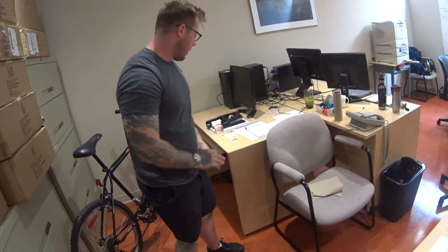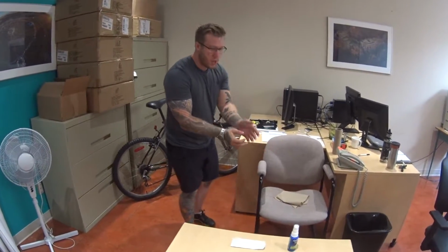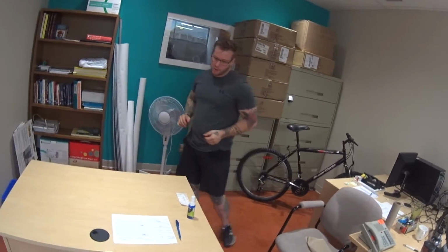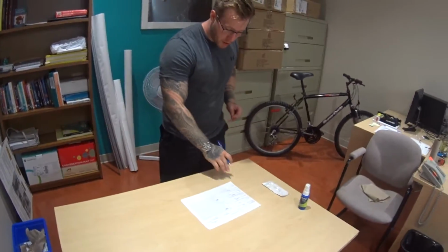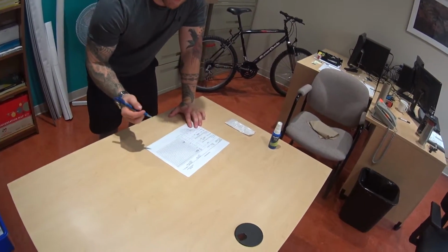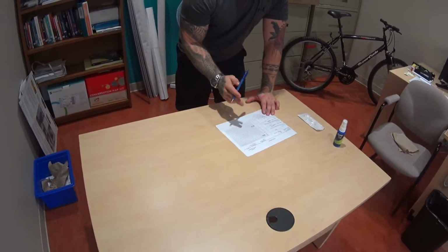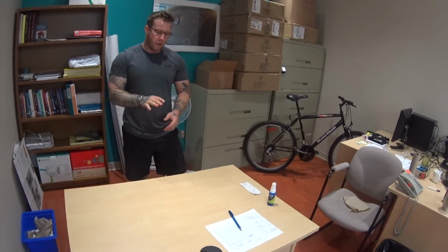I'm going to leave the room, taking all my supplies. I'm going to ditch my gloves and use hand sanitizer again, ensuring my hands are nice and clean. Then I'm going to come back to the med cart. We come to the med cart and look at Joe Milton. We're going to go down to his PRN section and sign off on the time of day that we gave him his PRN medication, ensuring we have proper documentation. And that about wraps up our IM injection demo. Thank you.